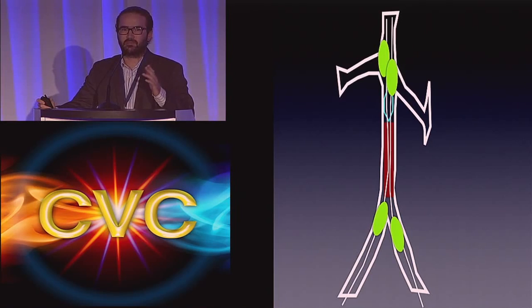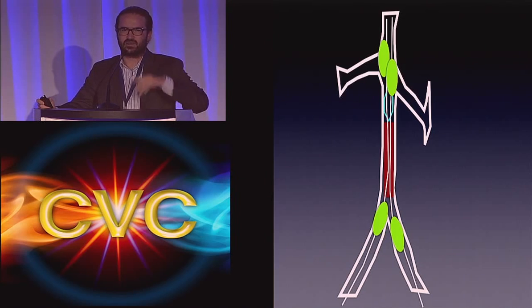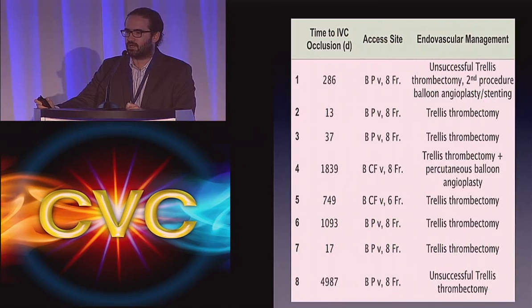So you're just creating vibration and disruption of clot rather than catching it in a whiplash manner. So actually after all these cases, we've had no technical issues. None of those cases have engaged in any way into the filter. And bear in mind that the majority of the filters were Cordis filters, and there were a couple of, I think, Select in that trial. So most of the procedures were successful, but one, and again, the technical success of the procedure was described as more than 75% clot burden removal on venography.